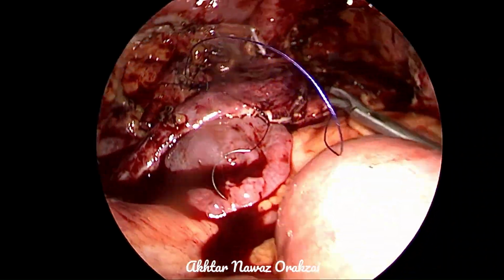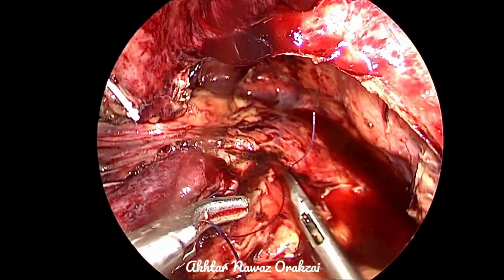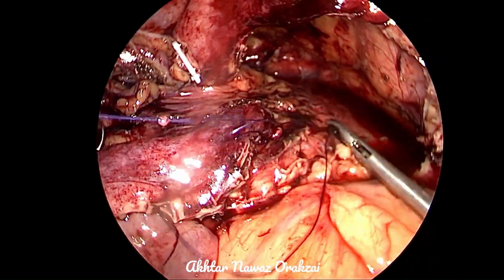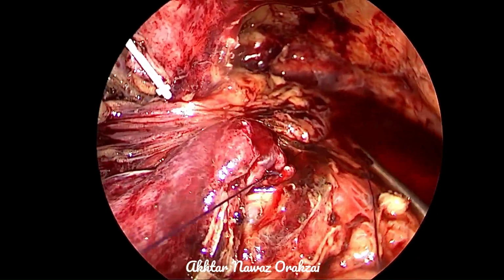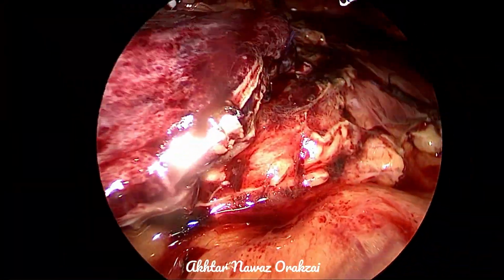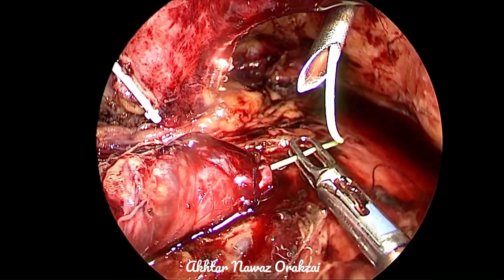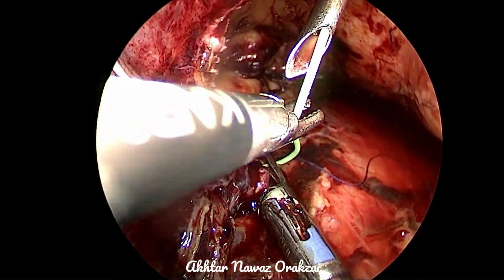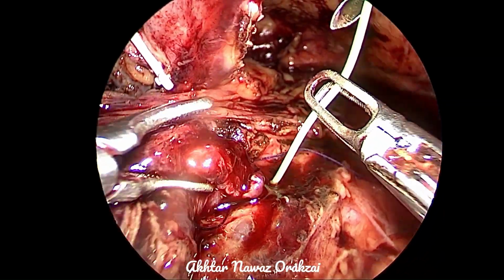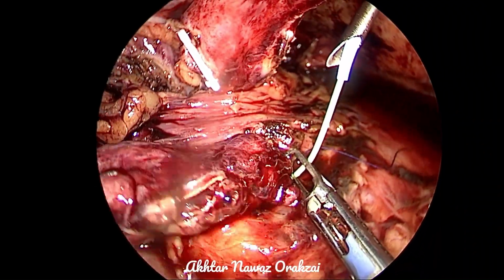It is important that when doing suturing laparoscopically, the suture must not be more than 20 centimeters, because then it is extremely difficult to handle it laparoscopically. Here you can see that the tail is also long, so we cut it and just bring it out. If there is a long tail, it also hampers. So we placed that same 2 millimeter needle port, and through that needle port we placed first the guide wire into the ureter.